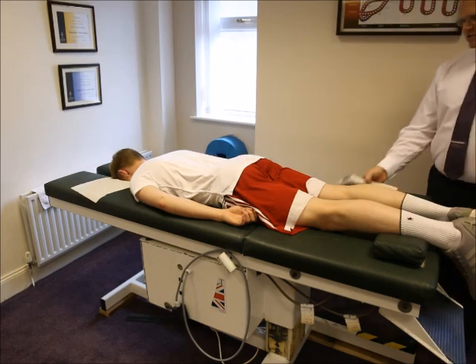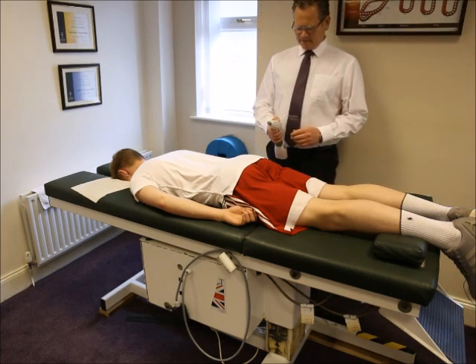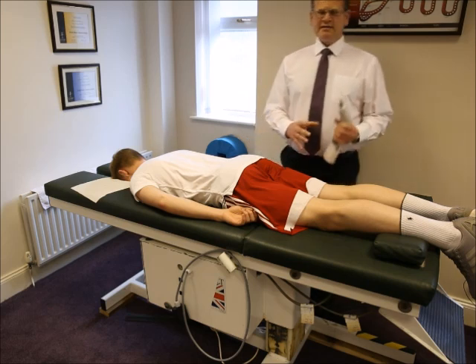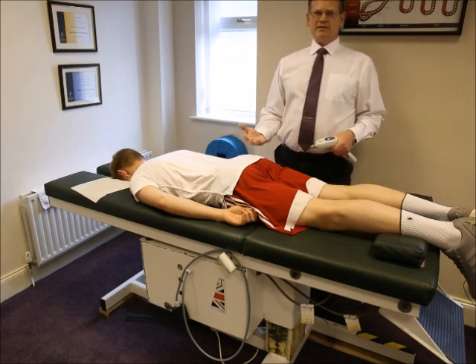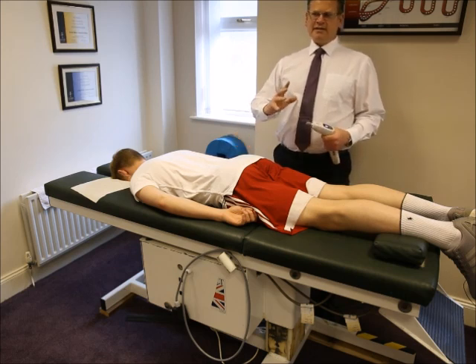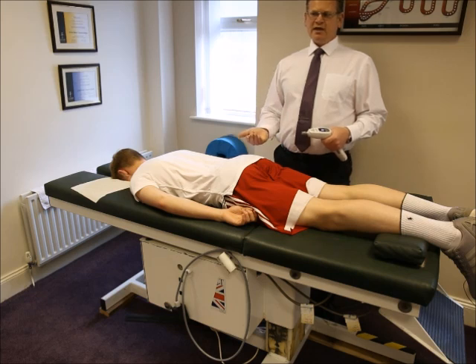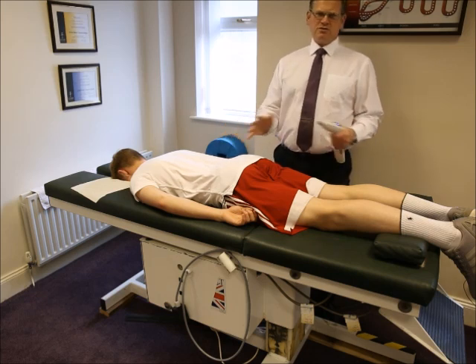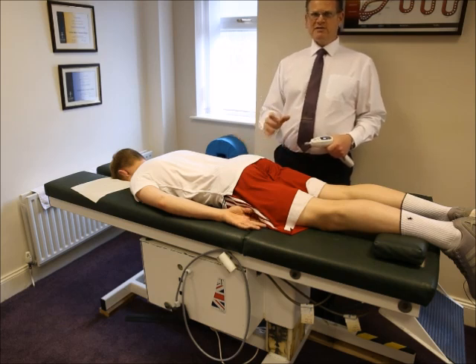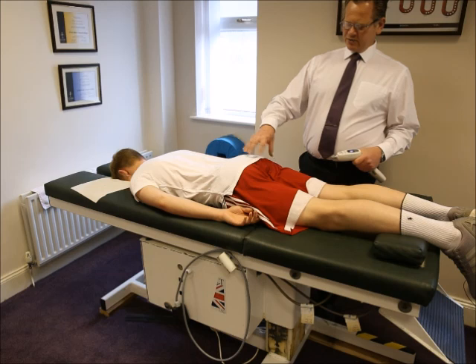We're going to contact the patient in three places. The device being used is called an activator — this is what we use for adjusting the patient. There are lots of different chiropractic techniques out there: some use physical adjusting, some use specially shaped cushions, and all sorts of other things. Here, the activator is what we specialize in, though we have a few different techniques available.